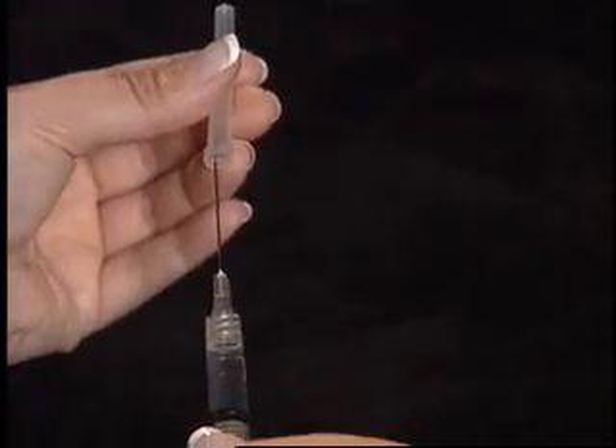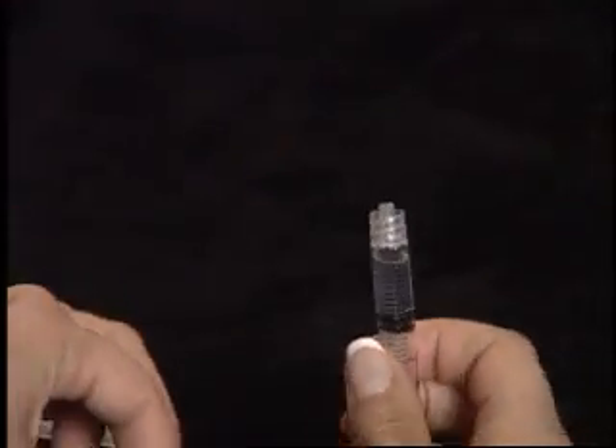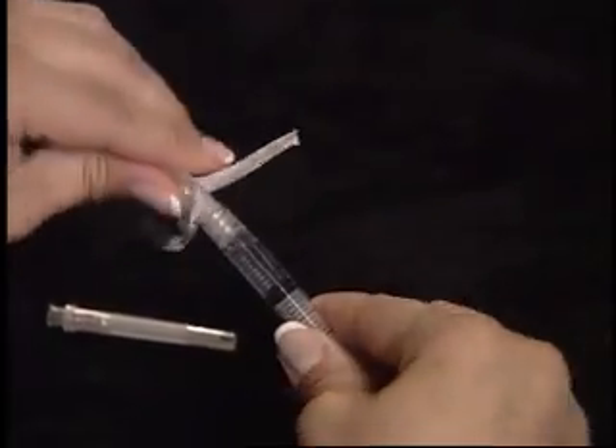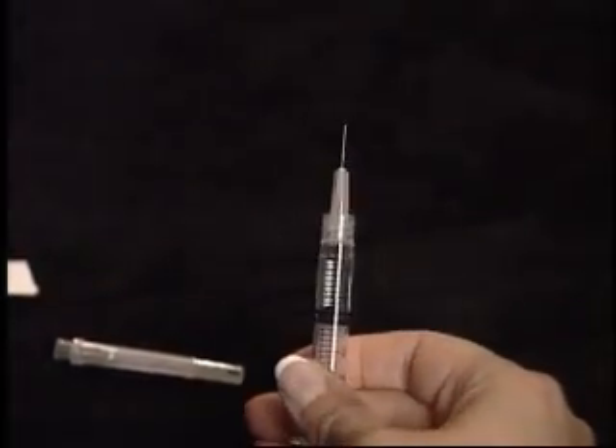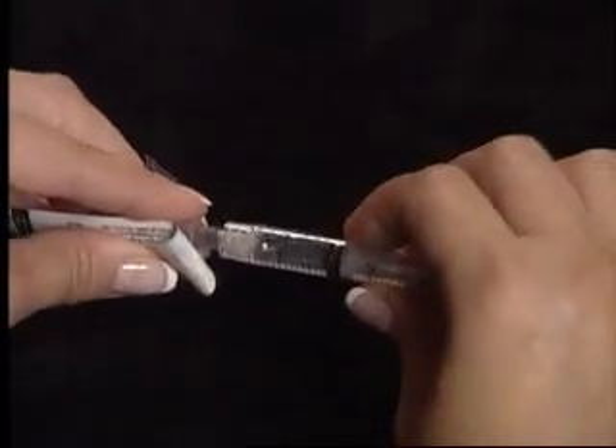Carefully replace the cap on the 1½ inch needle and remove it. Replace with a ½ inch needle for subcutaneous injection or a 1½ inch needle for intramuscular injection.